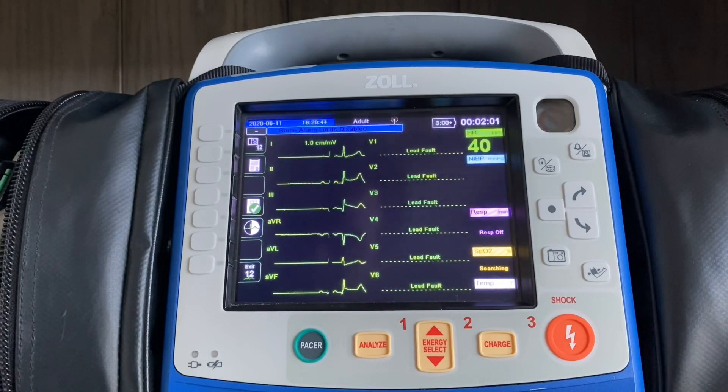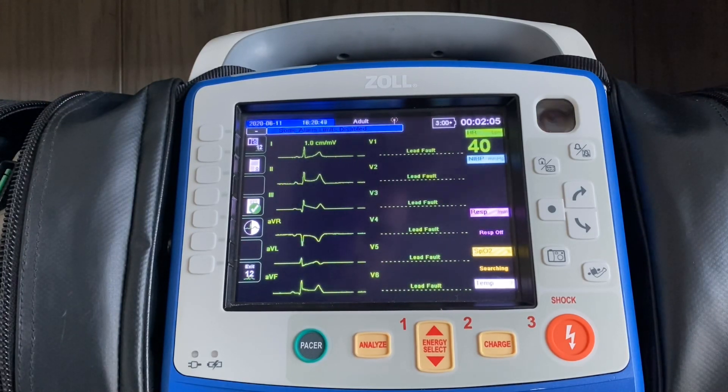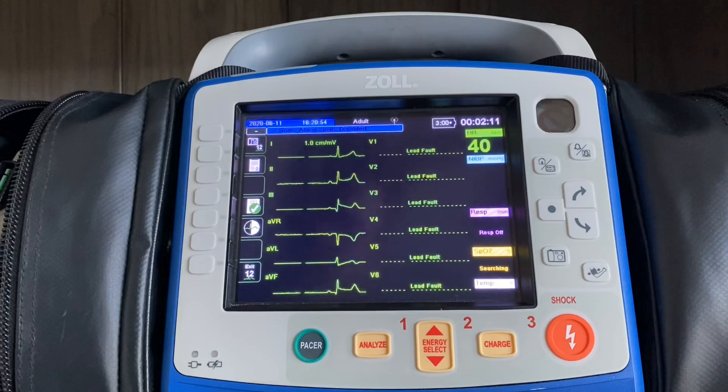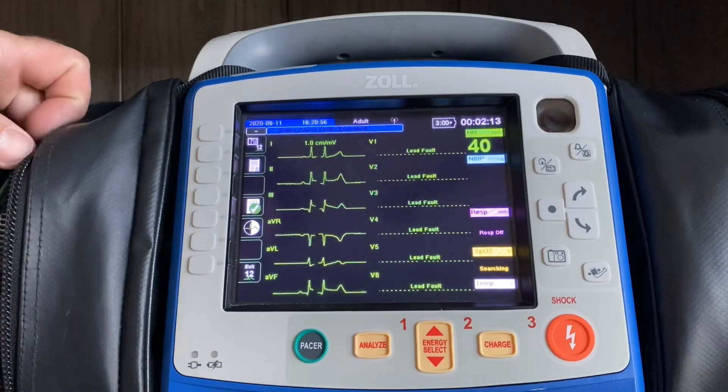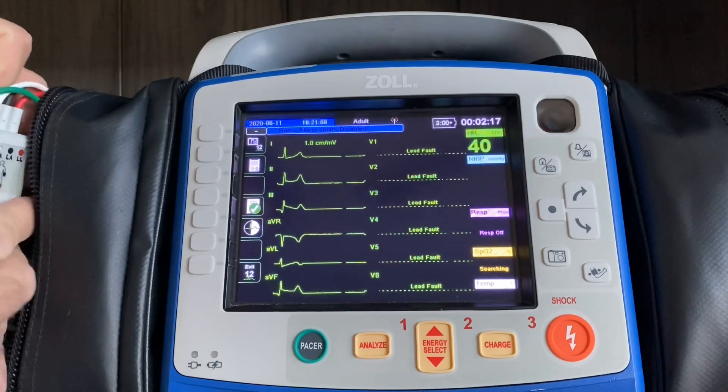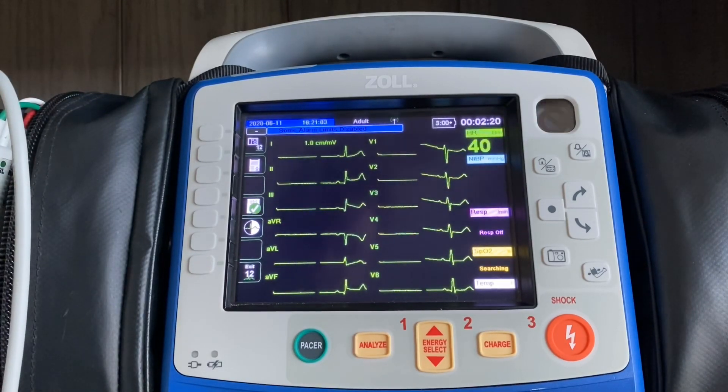If you hook into the junction point first, as soon as you put V1 down, there's a current running through there assuming the other leads have fallen off, and you'll continue to get a fault message on the device. So my V leads are going to connect in, and now I'll have all 12 leads on the screen.